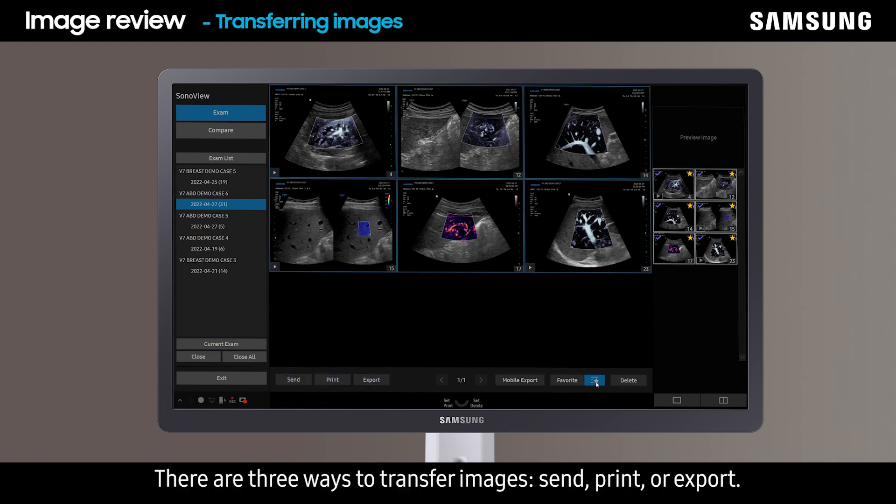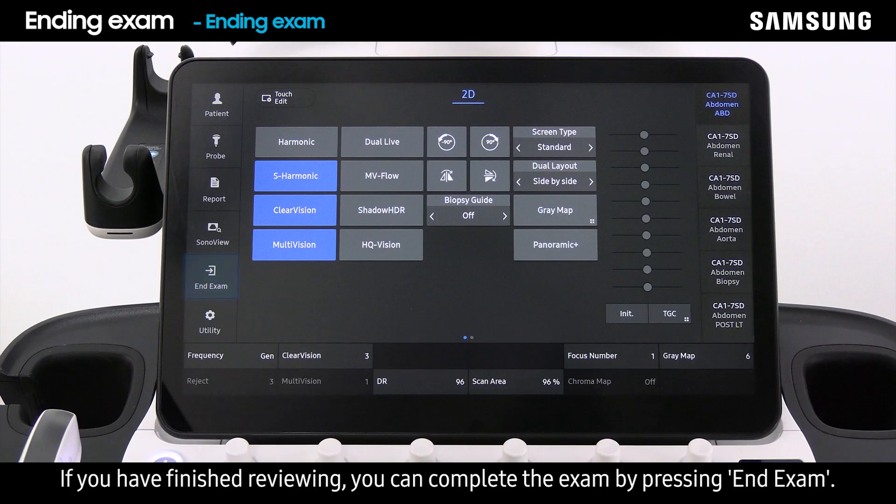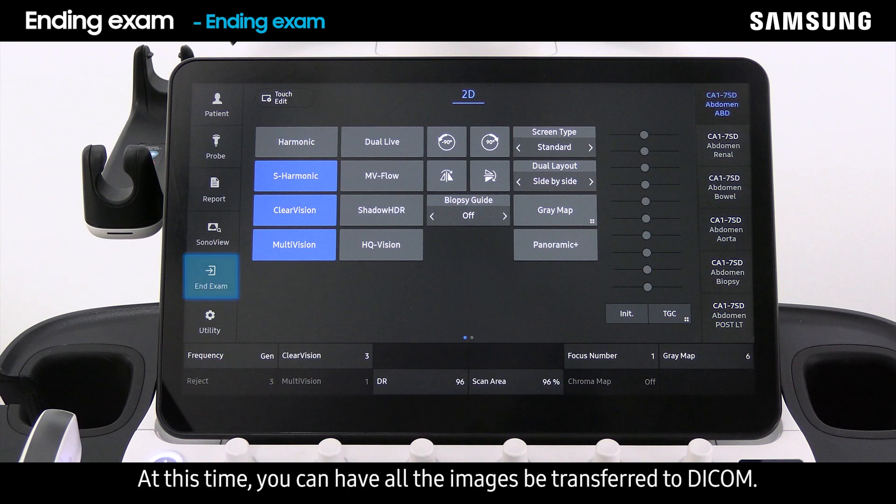There are three ways to transfer images: Send, Print, or Export. Click Send to transfer images to the connected DICOM. Select Print to print the image. You can export images to an external device like USB. If you have finished reviewing, you can complete the exam by pressing End Exam. At this time, you can have all the images transferred to DICOM.